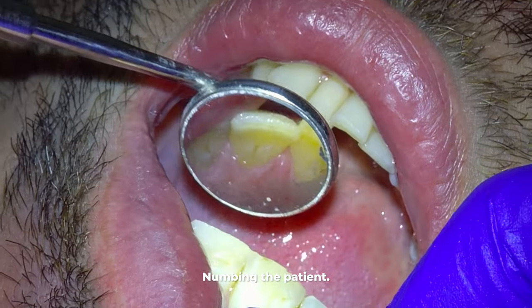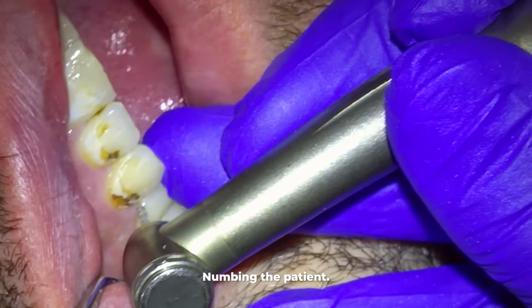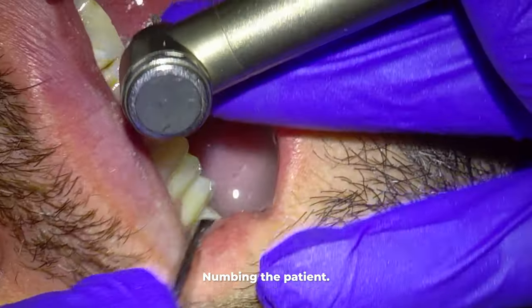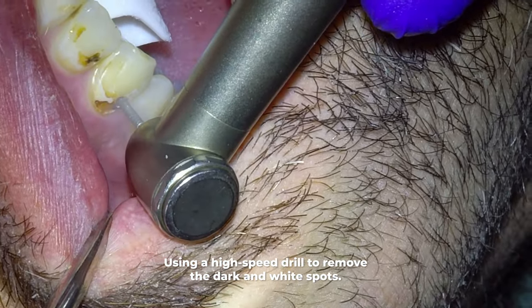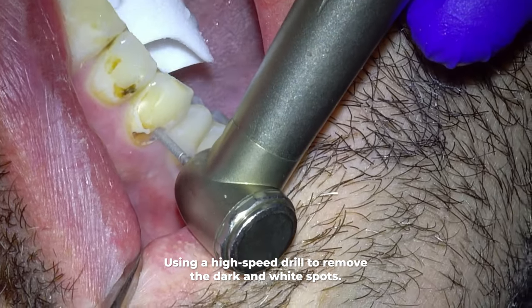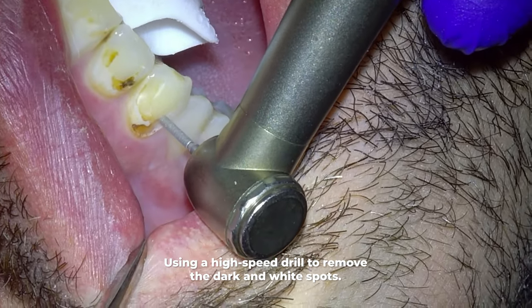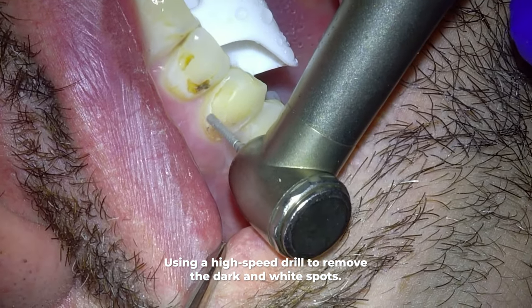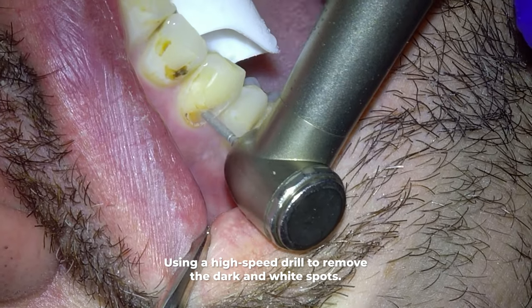As always we start by numbing the patient in this first of two appointments. Usually I would fix all these spots in one appointment, but this patient came in to take care of the cavities because that's what his insurance would cover. Once he saw how good it looked at the end of this appointment, he immediately scheduled to remove all the white spots too from these front teeth. So that's why we're doing it in two appointments.